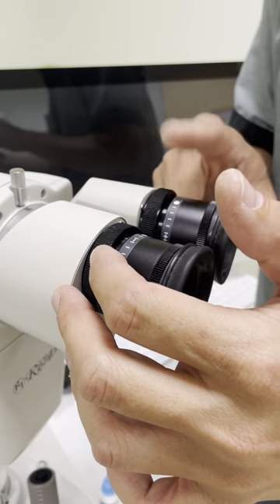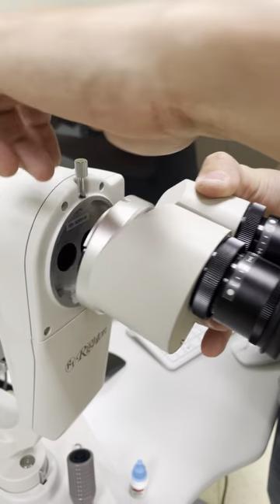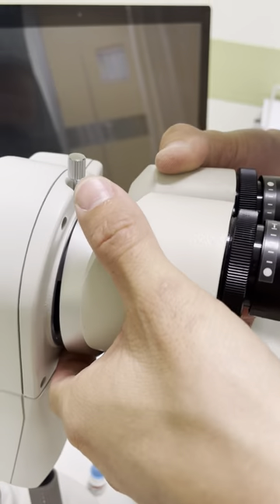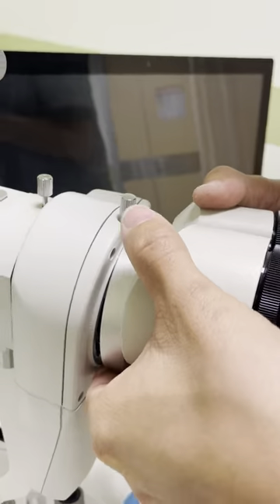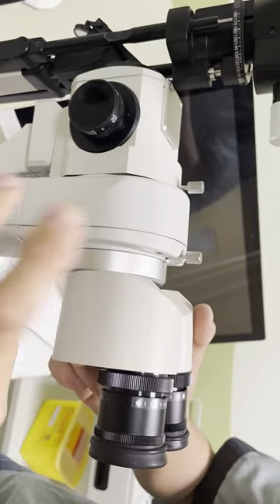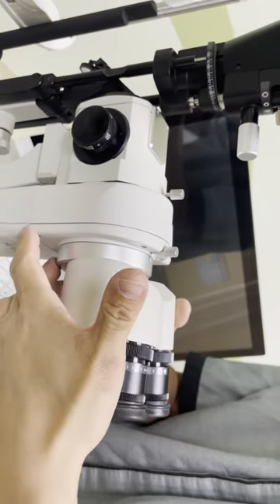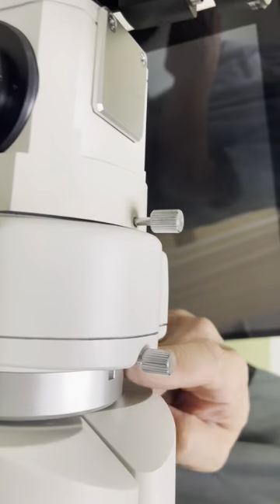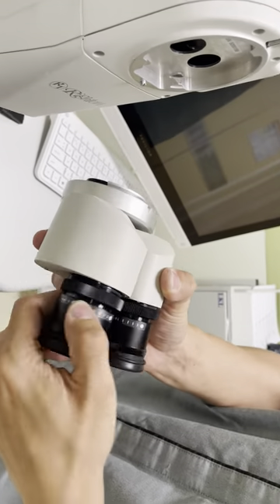This is called the binocular and this is called the eyepiece. You can detach here — there is a slot here, you need to put the slot here, then only it can go in. Make sure you hold it, tighten, hold first then only release. Make sure there is no gap here, no gap. For the eyepiece, you can attach here.